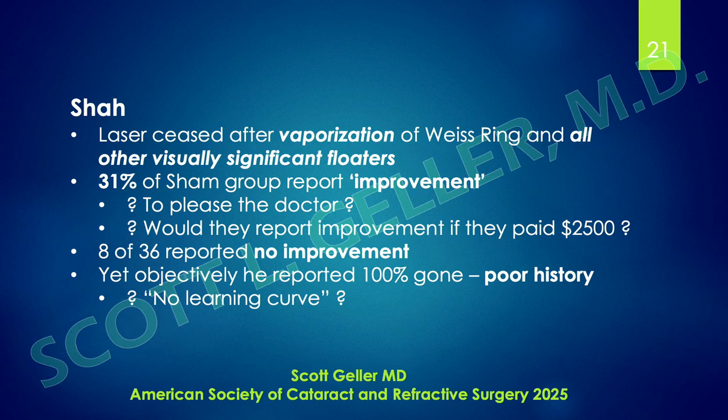I can tell you, as a matter of fact, they are not vaporized. Oh, there's gas bubbles, which are water vapor, of course, but they are not vaporized any more than a capsulotomy vaporizes a capsular tissue.